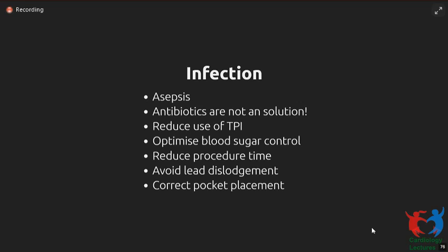So you should keep track of the rate of pocket or CIED infection in the first 6 months after implants. Generally, international rates would be about 2% or so. If your rates are higher than this, it's a cause for concern, and you should review all your practices. You should have a hospital infection team come and see the whole cath lab. They may have to lift swabs from various places and check for possible organisms growing on various things that you use in the lab.